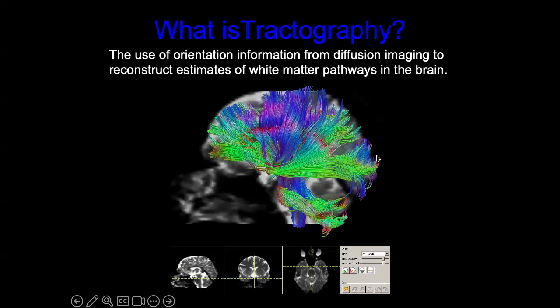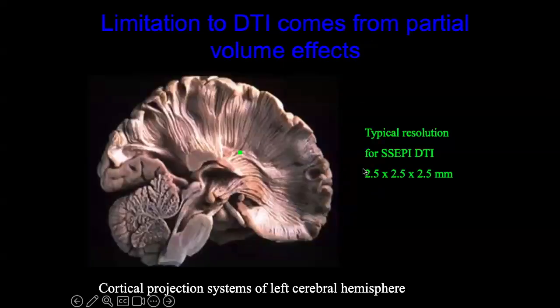And this data, sometimes it can be analyzed with models other than diffusion, and I'll talk about that. And why would people do that? Well, there is a limitation to DTI that comes from effectively a partial volume effect.